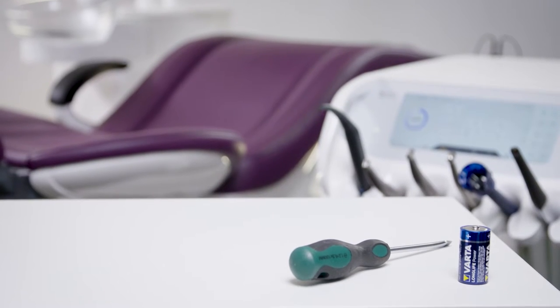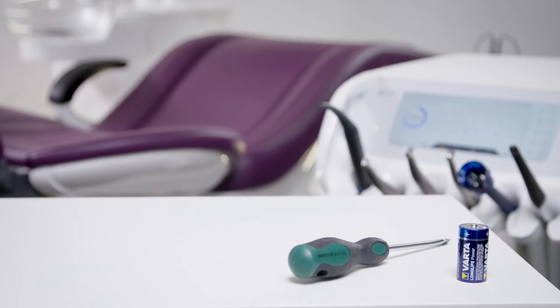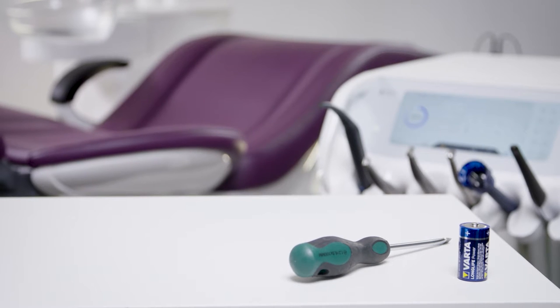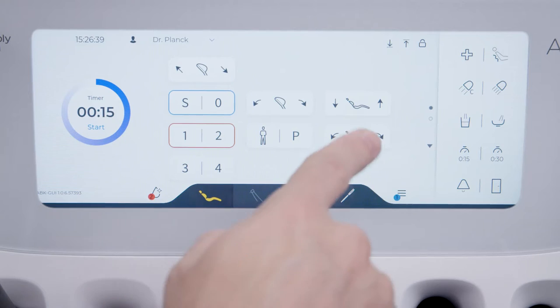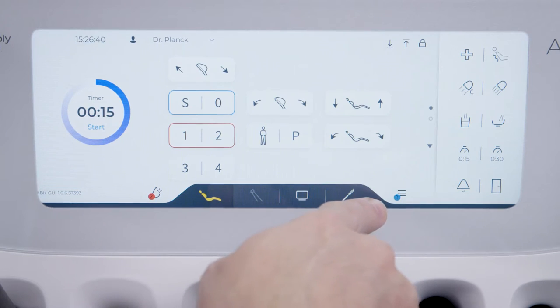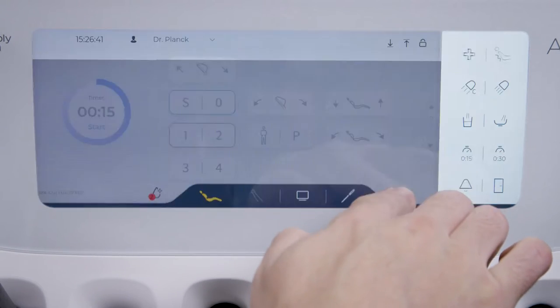When your smart control foot control battery is empty, you will get a message on the smart touch operating panel.